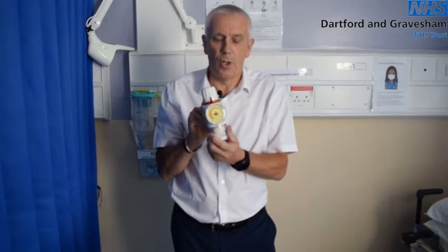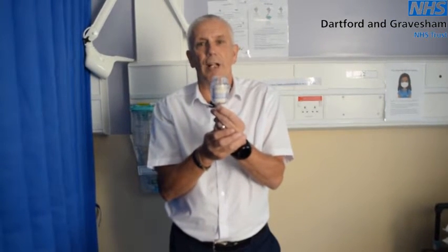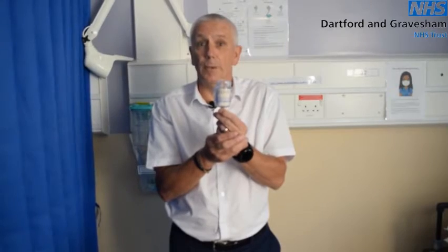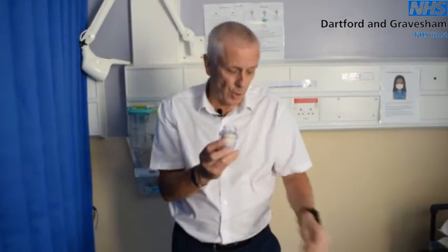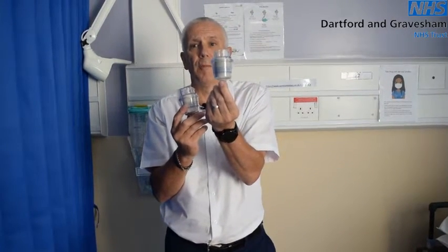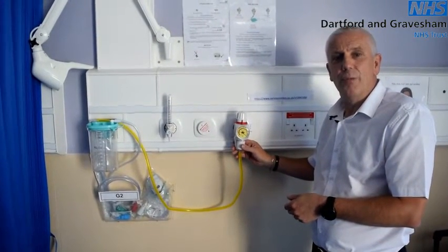These pipeline protectors are quite unique in that if they get wet they will turn pink or go a speckled colour, as seen here. These pipeline protectors are recommended to have an annual change unless contaminated. In a high use area they are recommended every three months — such as ITU, A&E, Endoscopy, somewhere like that. Generally, as soon as they change colour they should be changed immediately. The pipeline protector, or filter as it's commonly known, should also have a date on it of when it was changed.